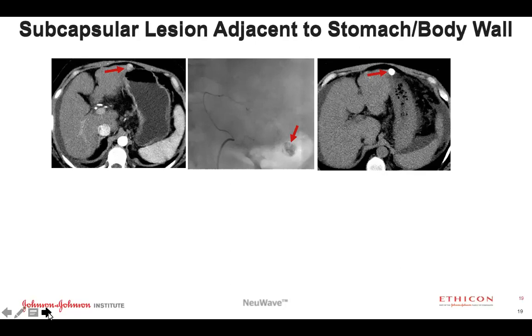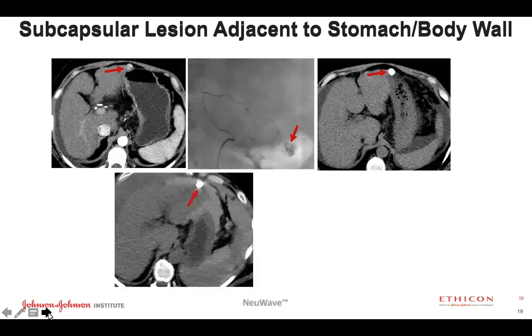So here's that lesion after chemoembolization. We like to do a lot of dual combination treatment, especially depending on the lesion of origin, but oftentimes with HCC, for example, we do chemoembolization followed by ablation. With the larger tumors, we feel it helps improve the ablation efficiency. With the smaller tumors, we feel it helps with our targeting. So I show this just to explain why this tumor is so bright on that picture on the right. That's after chemoembolization. And then here's our hydrodissection fluid. Now, hydrodissection is relatively straightforward. Once you get the hang of it, it's something that we employ quite a bit.